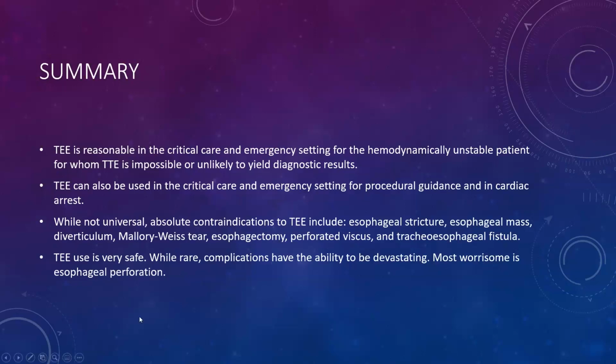But it is, on the whole, very safe, but the complications, particularly perforation, have the ability to be devastating and fatal.